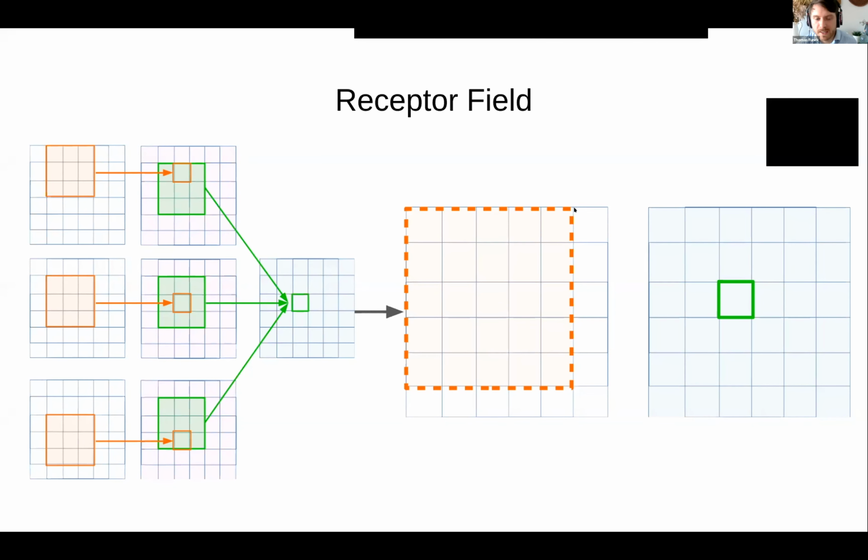So what that means is, as you add more layers to your network, the receptive field for the deeper layers increases and gets larger and larger. And so it can pick out or identify really high-level features in your original image.